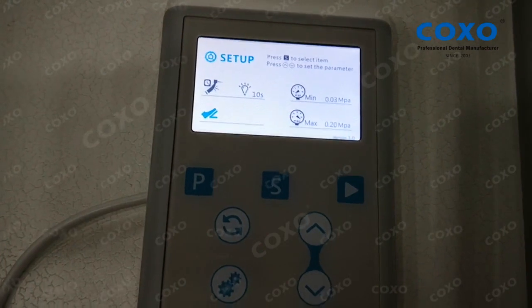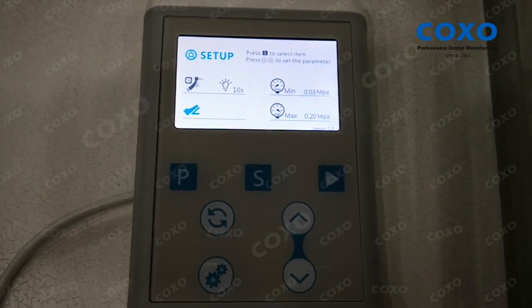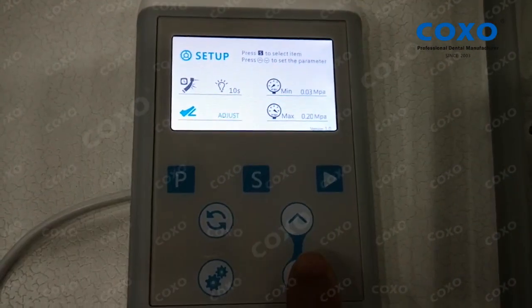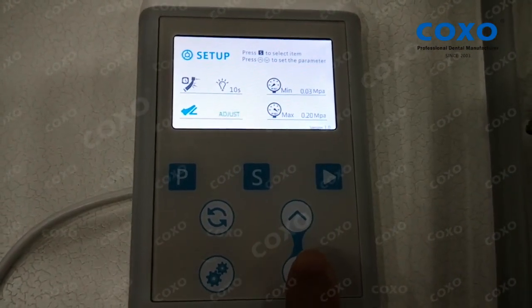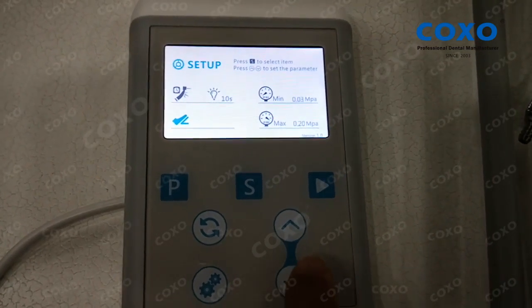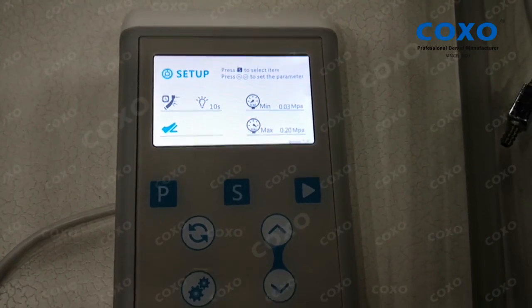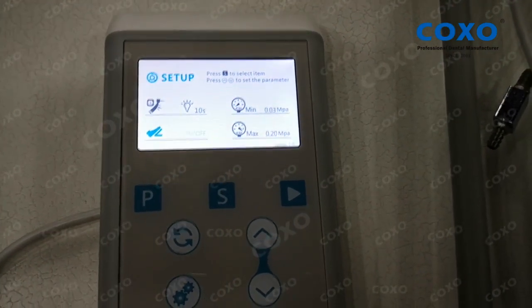Press the set button again and you can set the foot control — whether you want to use the foot control to turn the motor on/off or to adjust the speed. If you set adjust, it means use the foot pedal to control the speed. If it's on-off, it means use the foot pedal to turn the motor on or off.